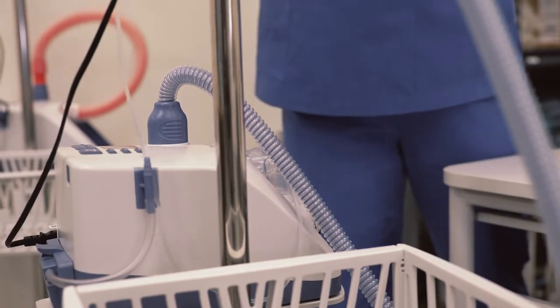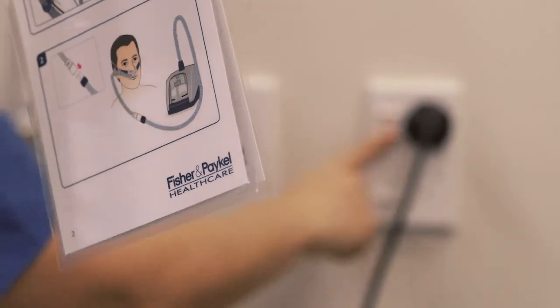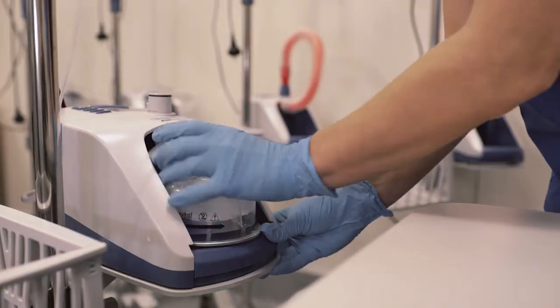It's easiest if you leave the Evo2 on the mobile pole stand. Switch off the unit and unplug from the mains utility power socket. Remove the breathing tube, water chamber, and water bag, and safely dispose of them.